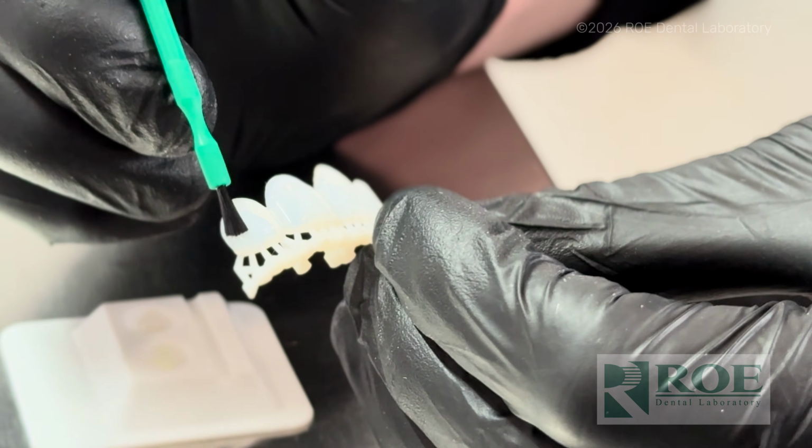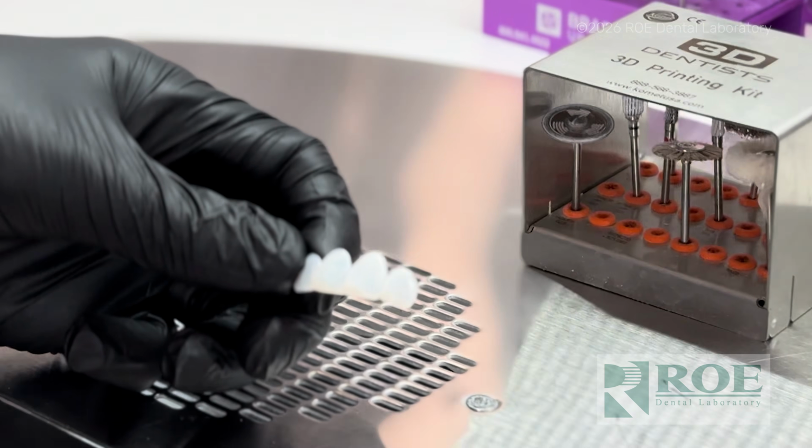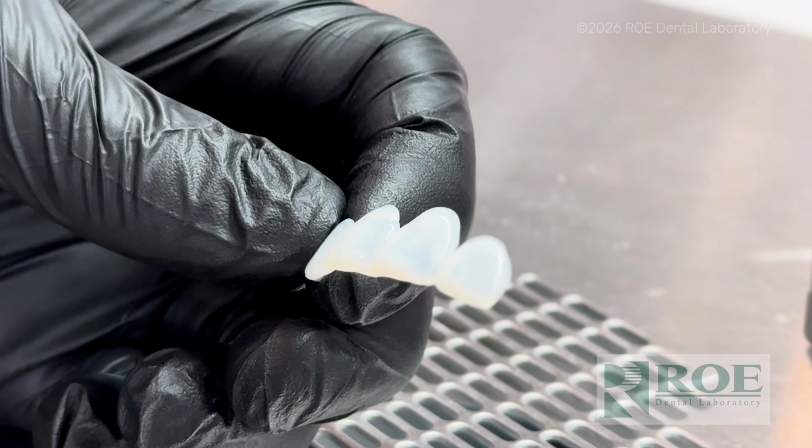Now, I do like glaze for temporaries, because I'll just literally put it on like this. And when it's done, it's like, holy buckets. Like, it literally looks like ceramic. So it's just this amazing, amazing, amazing workflow.